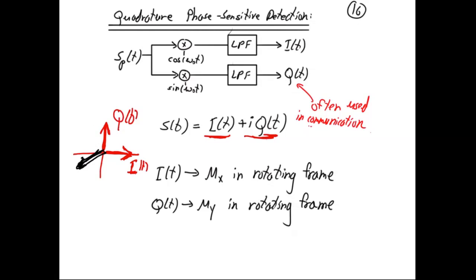We're going to derive that, and also for the case of relaxation, what happens in relaxation. After we derive this, we're going to solve the Bloch equation for excitation, and we're going to solve the Bloch equation for reception, which would lead to this Fourier relationship again. So we're going to see it in several different ways, so you can have slightly different perspectives on how people think about those things. Okay.